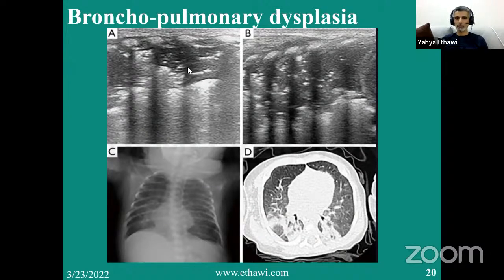You'll see air bronchogram. You can see B lines are wide, matted, reaching to the end, and you can see we are losing the pleura. You can see it more severe as the lesion goes below, but something is telling you it's not pneumonia, because it's not a localized shredded sign, it's everywhere. And you can see the B lines are inside it.